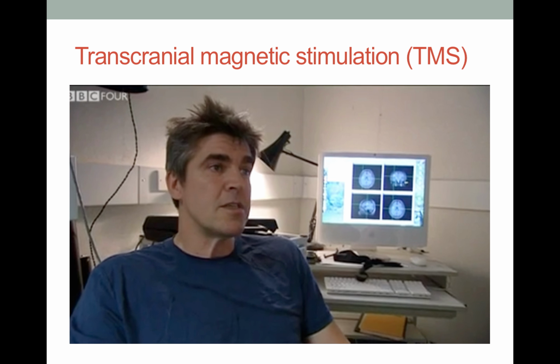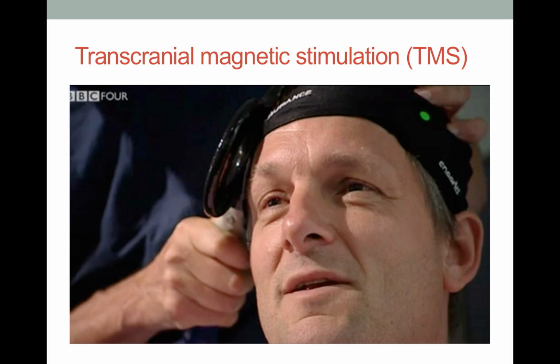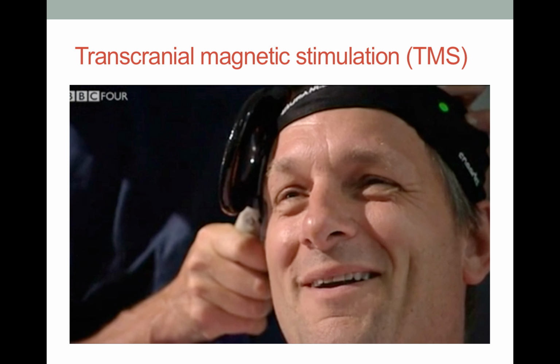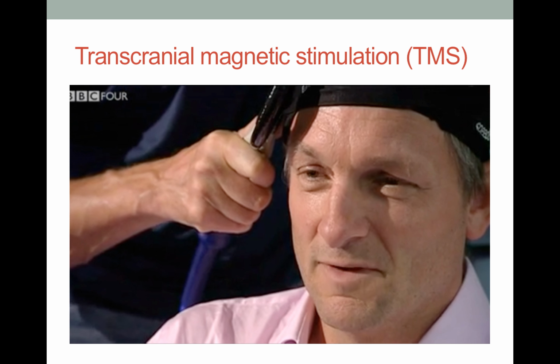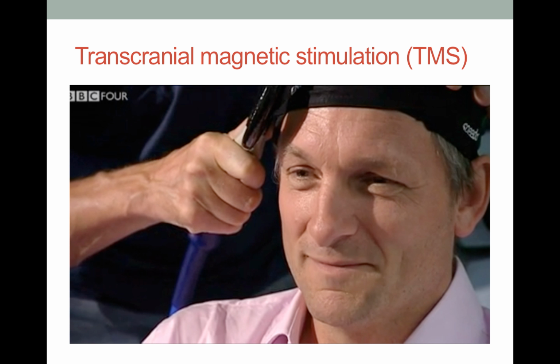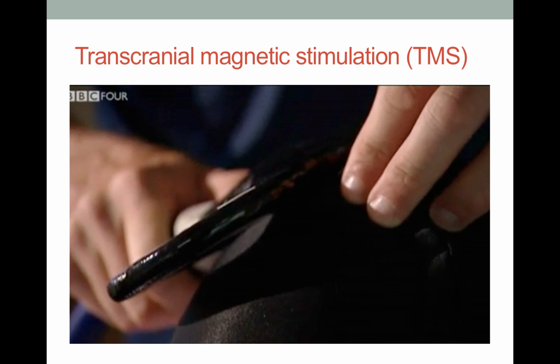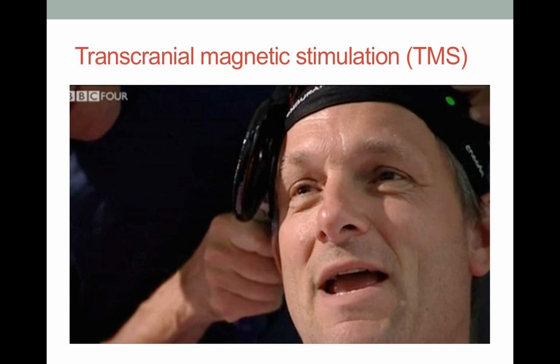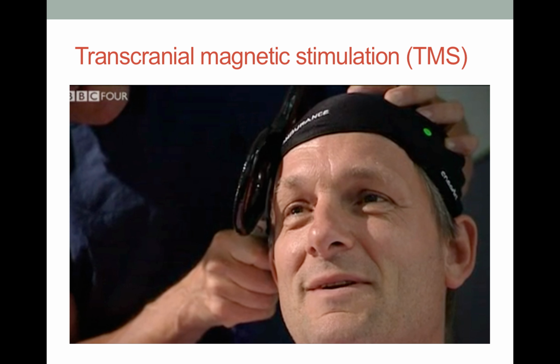We've interfered with the ability to compute with numbers. 6, 7, 8. Okay. Ooh, yeah. Yes. We've interfered with the ability to speak. London Bridge, London Bridge, London Bridge is falling down. You think of something you can do, and we've basically interfered with it with this machine. 2, 3, 4, 5, 6, 7, 8, 9. So what's the problem? I don't know.